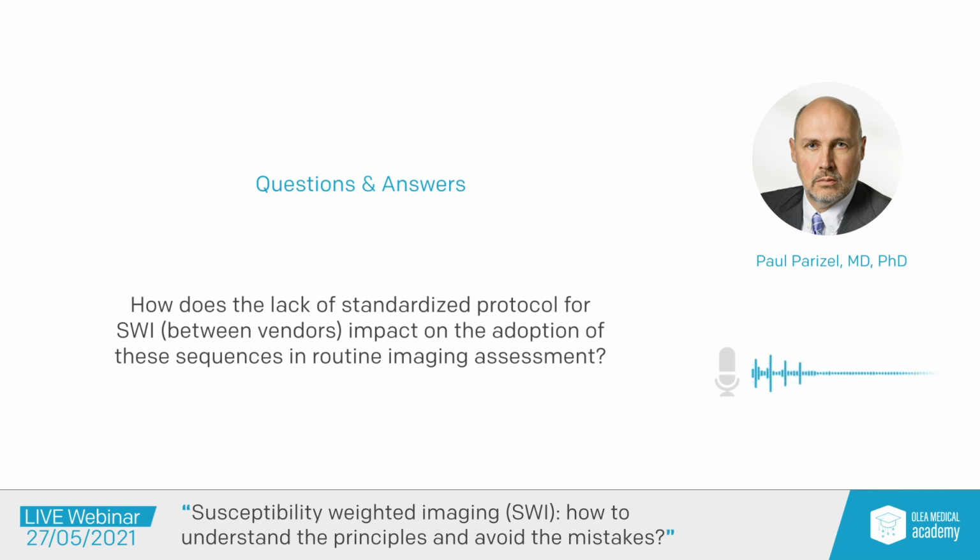It's a very good question, and thank you for that question. And that is a big problem. And the problem, and I'm not a legal expert, but I've always been told that the issue is that the original SWI sequence is patented and protected by legal patent, which means that other vendors have had to work around this.